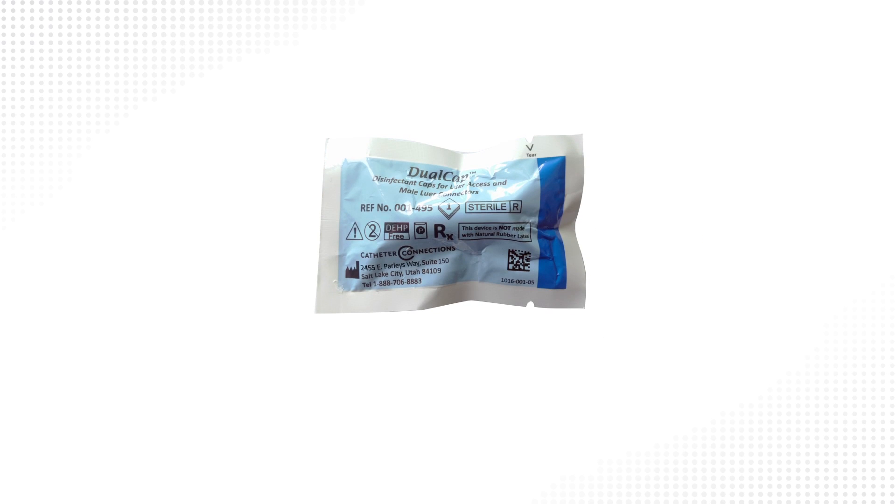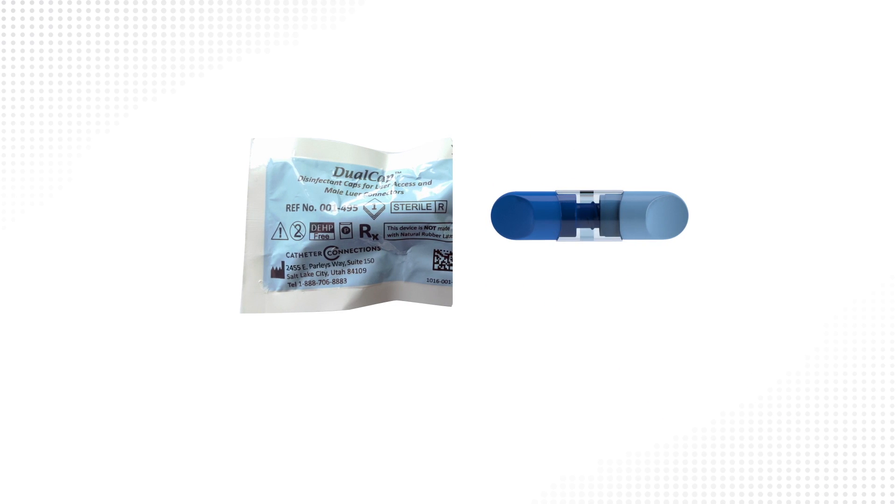To access dual cap in an individually wrapped pouch, gently tear open the perforated end of the pouch and carefully remove dual cap. Residual IPA on the exterior of dual cap may make the product slippery, so handle carefully.